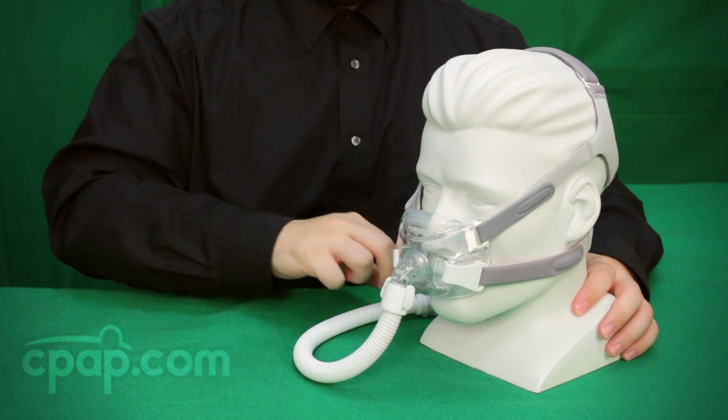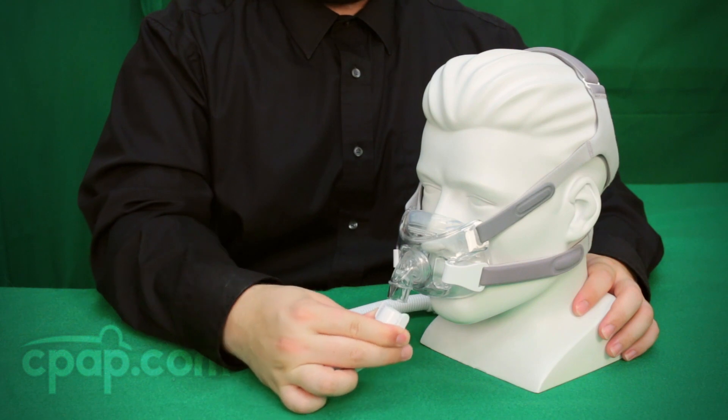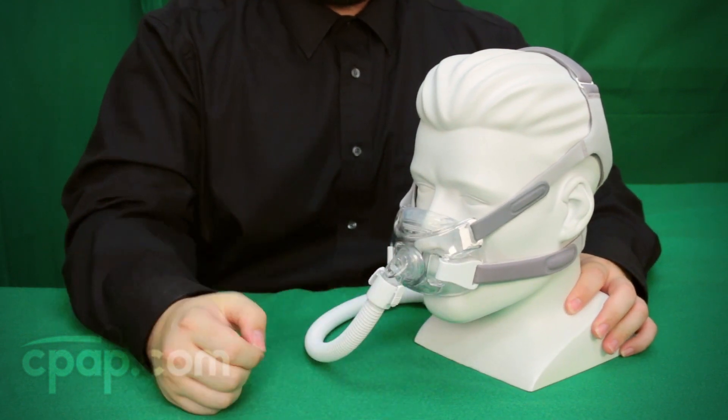The Amara View features a short tube which will connect to the longer CPAP hose. The short tube can be removed and replaced quickly and easily if interruptions to sleep should occur.